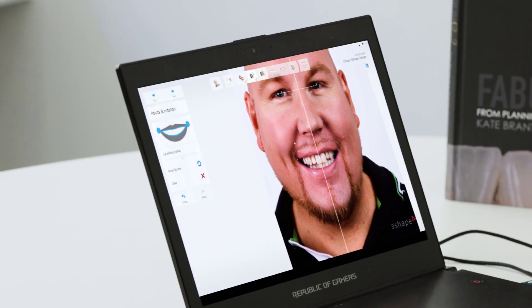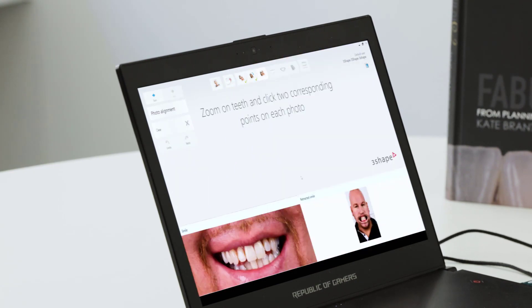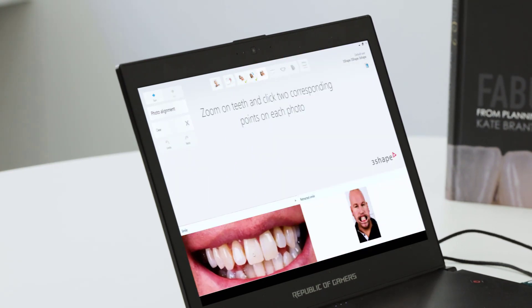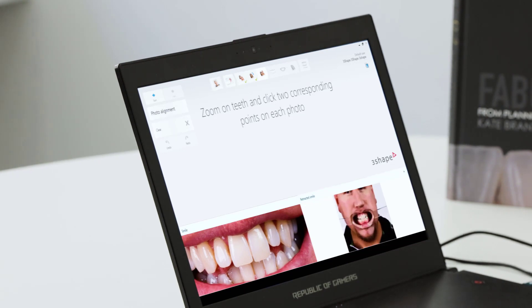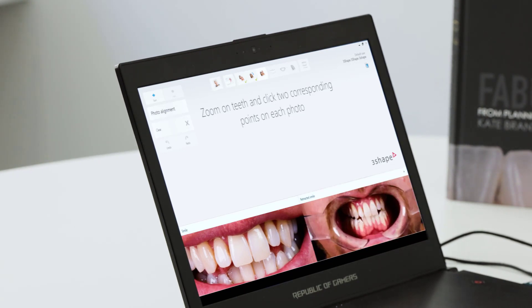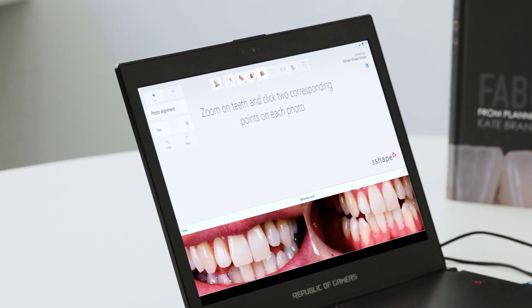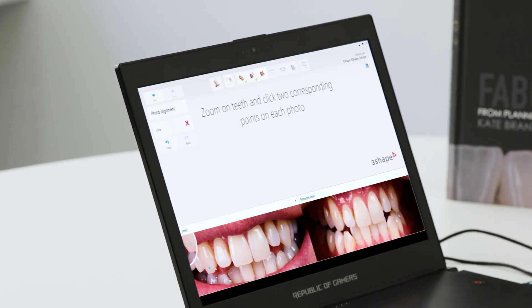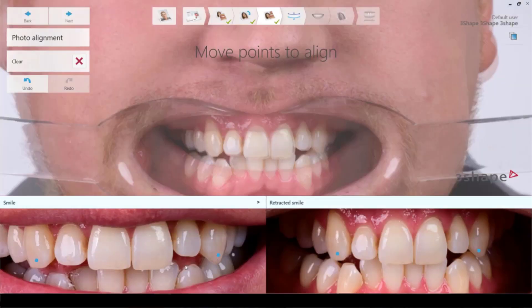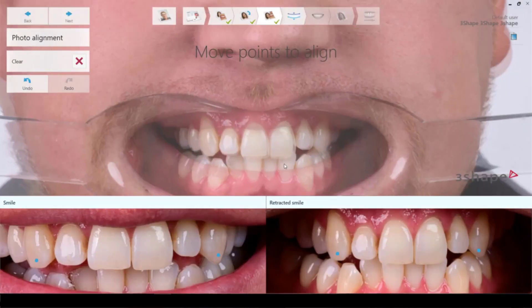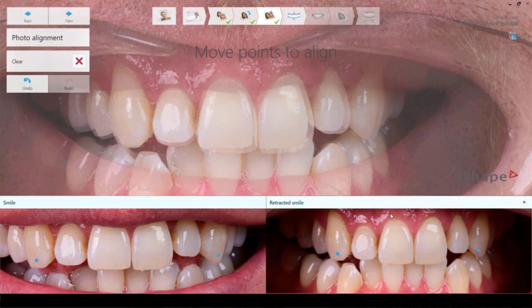When we're satisfied, we go to the next step. Now we're going to match the non-retracted photo with the retracted photo. This is basically to have the outlines for the smile design — to see where we may need to move some gum, etc.